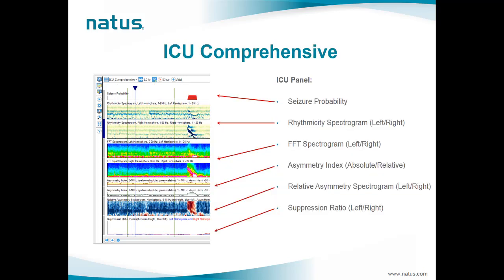The ICU comprehensive template, or panel, is the default panel used in NeuroWorks. The panel is composed of six trends: seizure probability; rhythmicity spectrogram for left and right hemispheres; FFT spectrogram for left and right hemispheres; asymmetry index — absolute and relative — with asymmetry spectrogram for left and right hemispheres; and suppression ratio for left and right hemispheres. Users are able to add more trends to the current panel by clicking the Add button in the main menu.